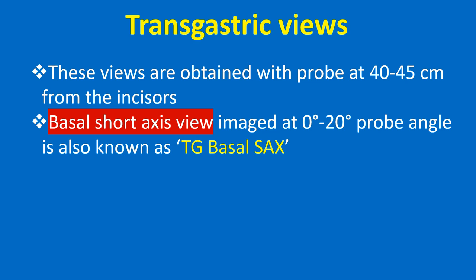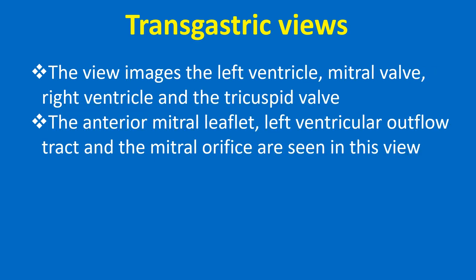Transgastric views are obtained with the probe at 40-45 cm from the incisors. The basal short axis view is imaged at 0-20 degrees, also known as TG Basal SAX. The view images the left ventricle, mitral valve, right ventricle, and tricuspid valve. The anterior mitral leaflet, left ventricular outflow tract, and mitral orifice are seen in this view.